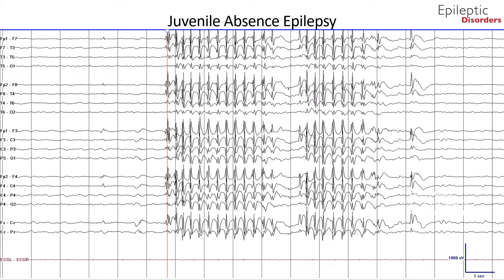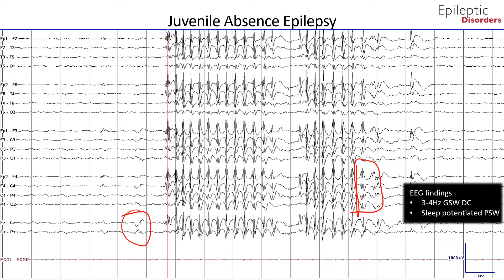This is a bipolar montage of a 13-year-old boy with juvenile absence epilepsy showing typical 3 Hz generalized spike and wave discharges during the drowsiness state, as depicted by the vertex waves outlined in the red circle preceding the generalized spike and wave complexes. During sleep, the discharges become more frequent and brief with an enhanced poly spike component, as outlined by the red box, especially during stages one and two of non-REM sleep.